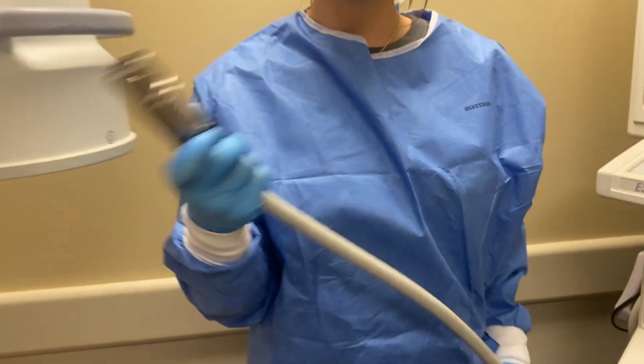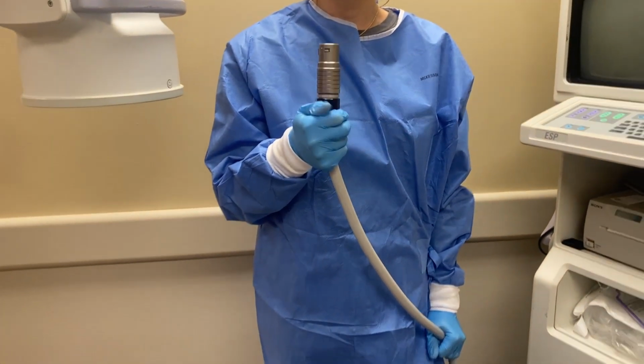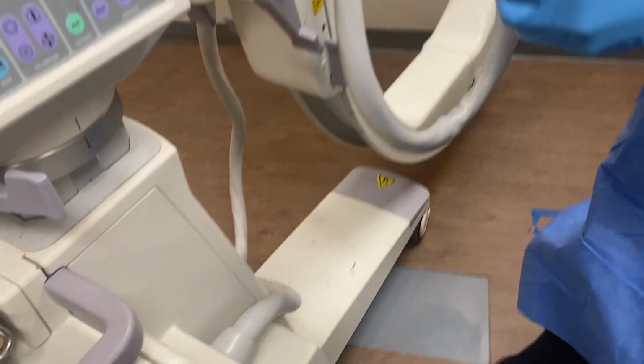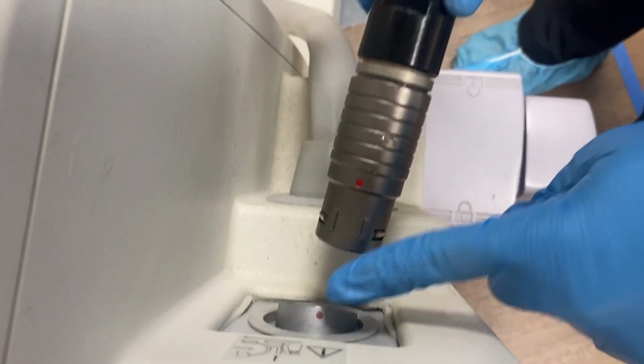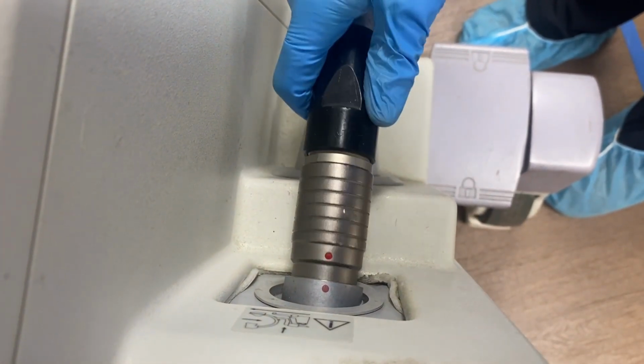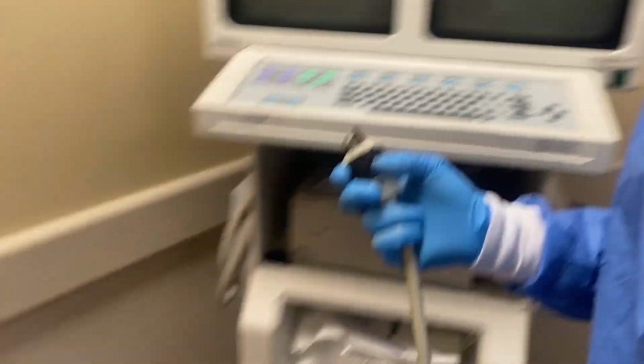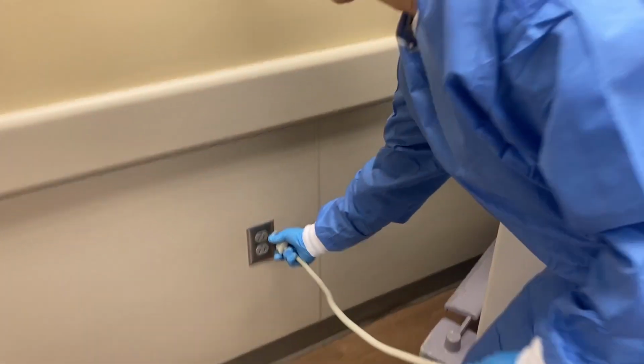It is important to plug in our C-arm and monitor in a set order. First, we take the cord from the monitor and plug that into the C-arm, and then we take the power cord and plug that into an outlet. As well, there's going to be an Ethernet cord that gets plugged in the surgical suite. The Ethernet cord makes sure that our images are sent to PACS.